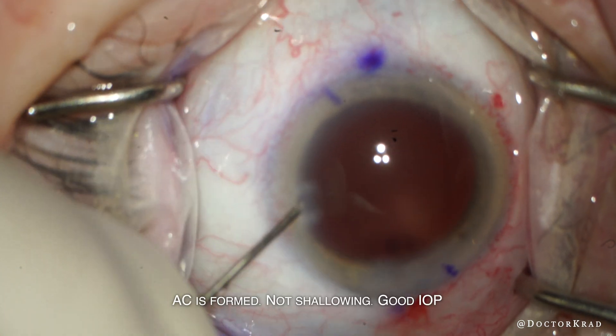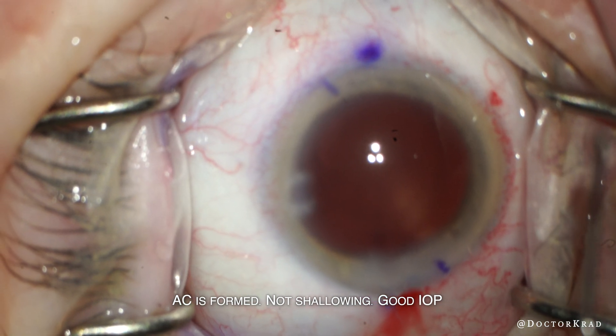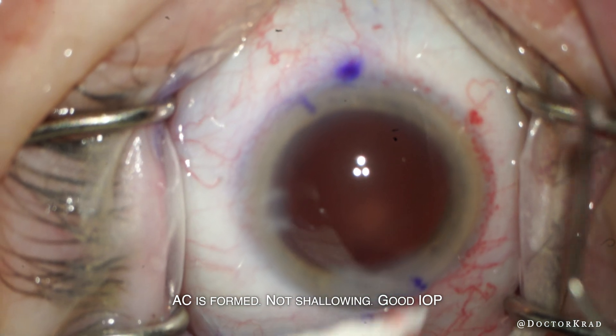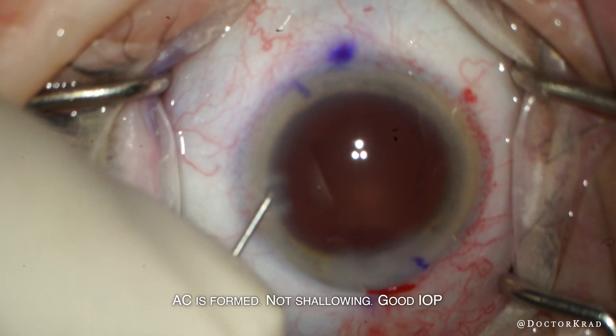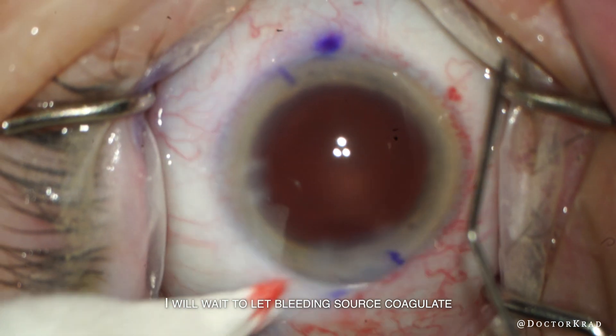The anterior chamber remains formed — there's no shallowing and the eye pressure seems good. So I decide to just make sure my incisions are watertight and the pressure is good, and I'll wait a little bit so that the source of the bleeding coagulates and stops.